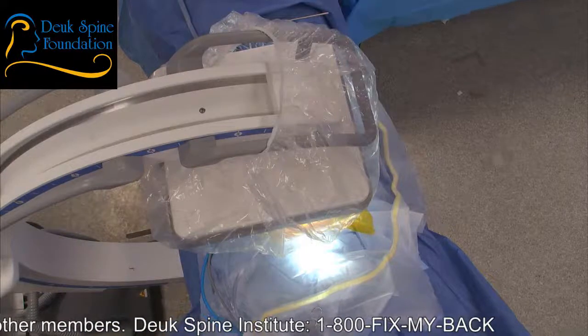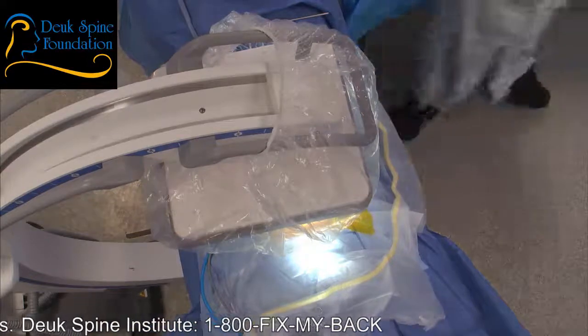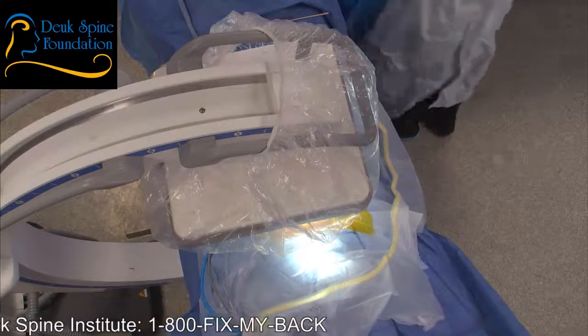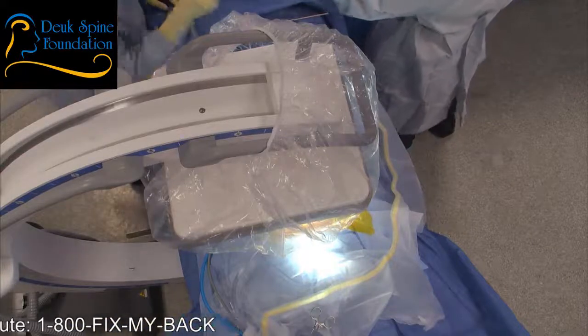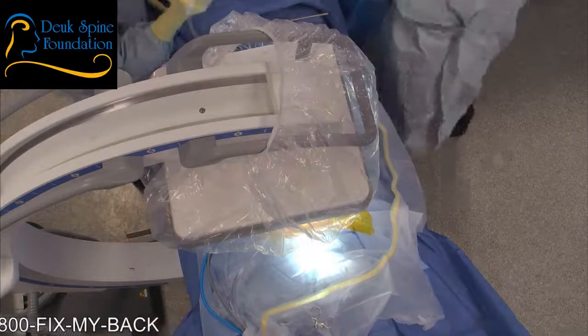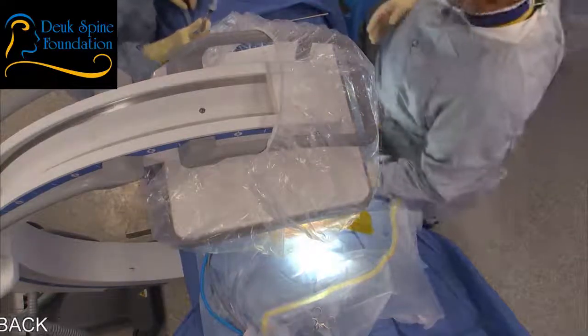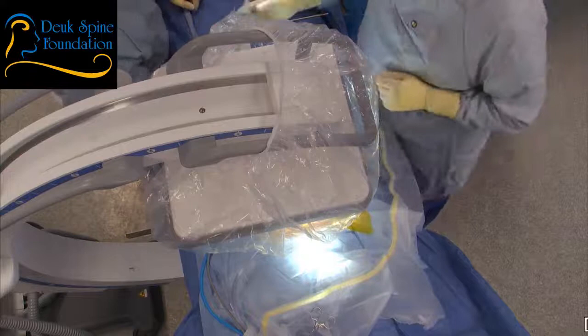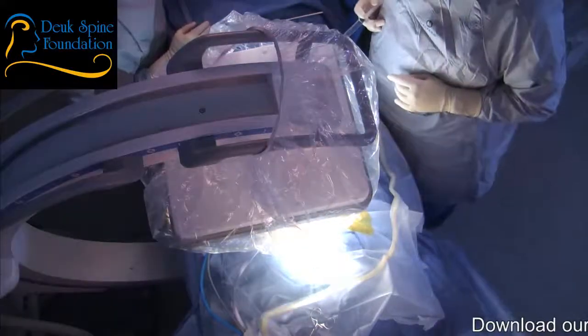So he's got two herniated discs, L4-5, L5-S1, and he has something called a pseudo disc, which is a fake disc at S1 and S2. So I need to know that because I use X-ray to guide to the discs that need to be fixed, and we got to know about the fake disc because that's going to be seen on the X-ray usually. Okie dokie, let's get started.